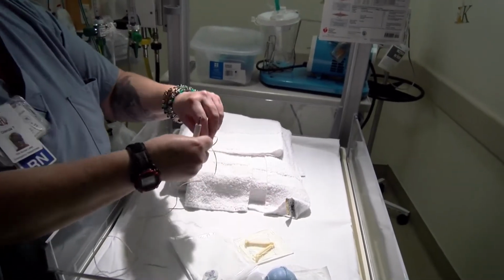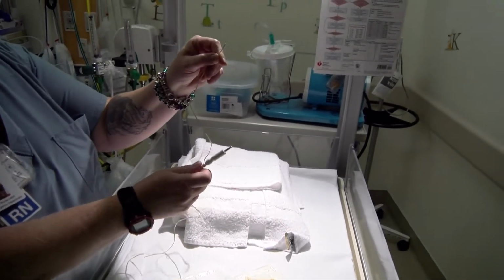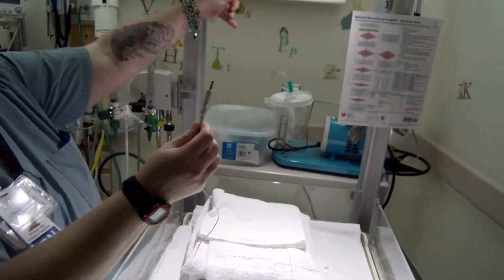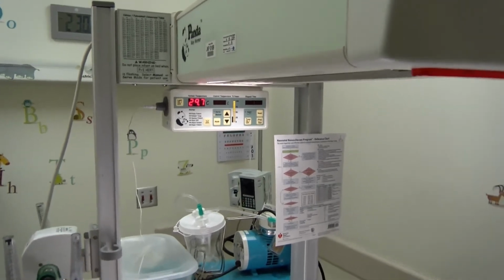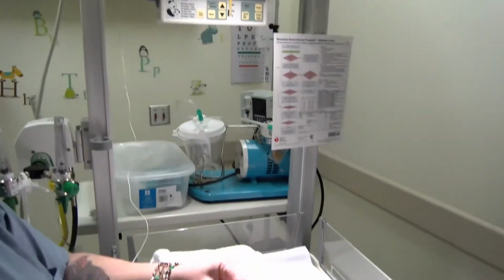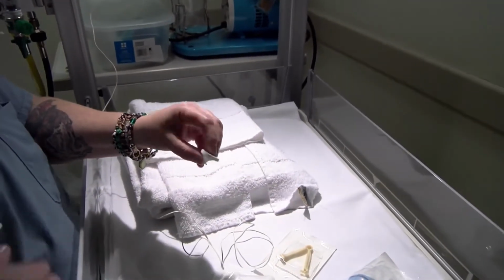This is the end of the probe that is going to be taped to the infant's abdomen. You're going to tape it to the right upper quadrant over the liver. This end gets plugged into here. And as you can see, it is now starting to read the temperature in Celsius. And it's picking up the temperature from the radiant heater. You have a little sticker that you will use to tape to the abdomen of the baby.